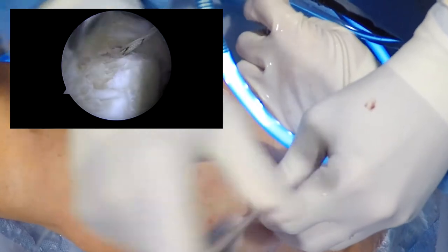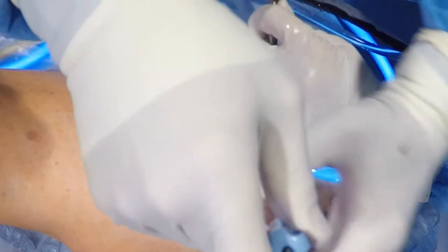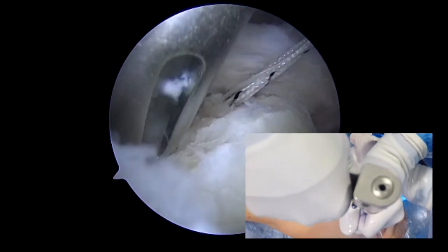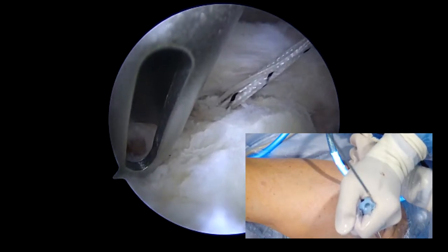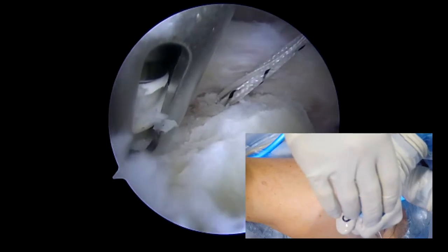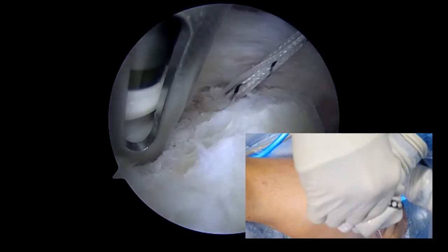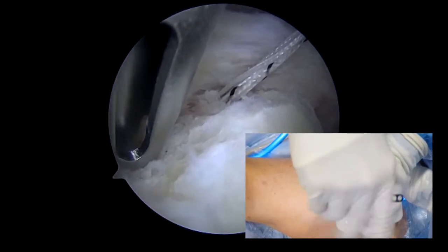There is essentially a guide wire inside a cannula. We are now drilling the hole for the more posterior glenoid anchor, and the anchor is being inserted. This will include a shuttling stitch that will be used to shuttle suture through the dermal graft on the most medial port.